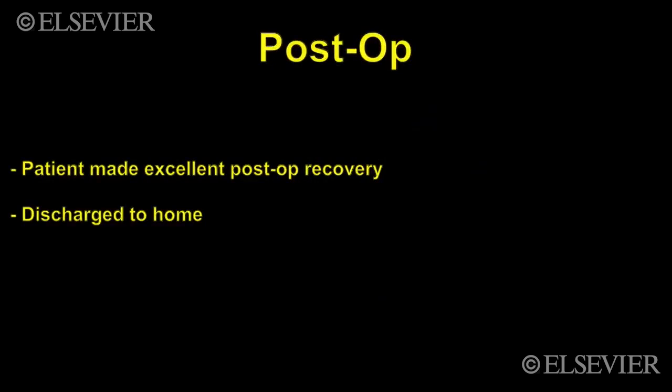This case demonstrates how a rotated anterior communicating artery complex has to be managed with adequate operative exposure, gyrus rectus resection, a wide Sylvian fissure split, and early exposure of the proximal vessels.